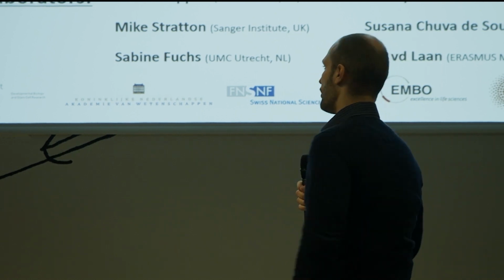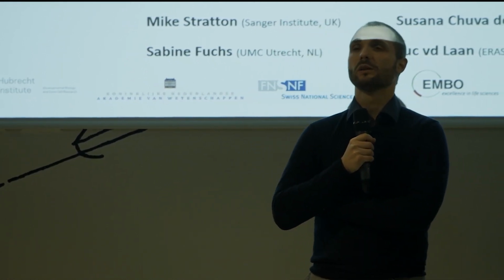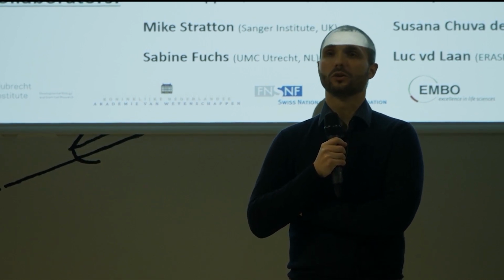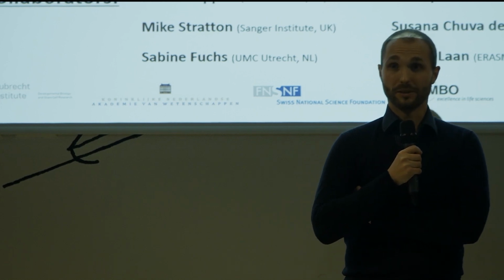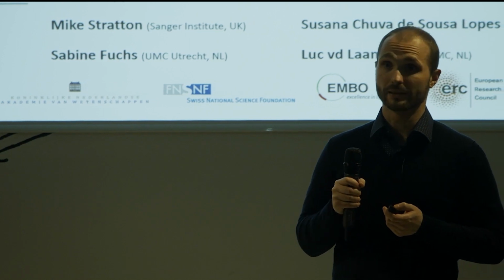So for almost all our organoid systems, let me start like this. In almost all our organoid systems, we have active Wnt signaling. We do not always add components of Wnt signaling because in many cases, these organoids produce the Wnts themselves. The liver is one of these cases. So for example, in the cholangiocyte system, we do not have to add Wnt, but what we do have to add is R-spondin, and R-spondin is essentially just a Wnt sensitizer, because these organoids produce Wnt themselves.